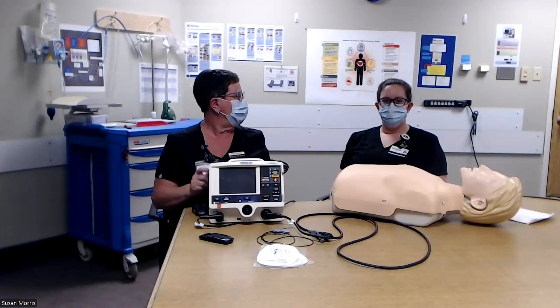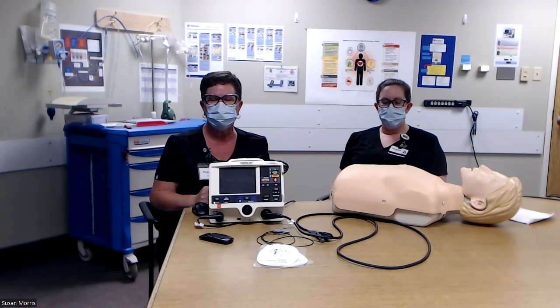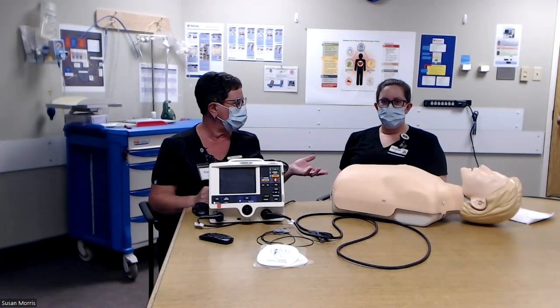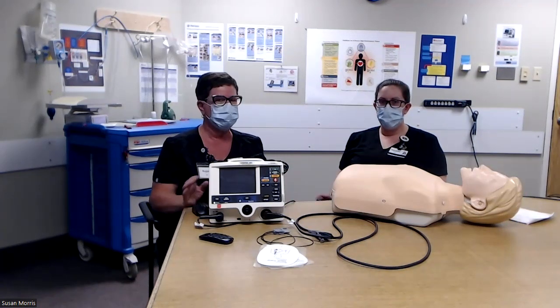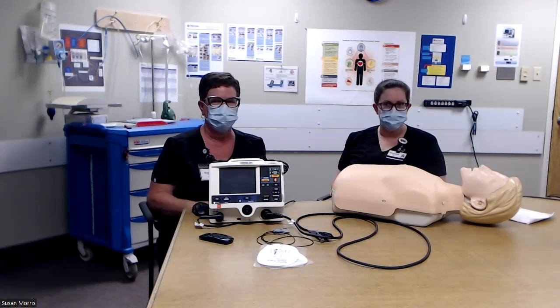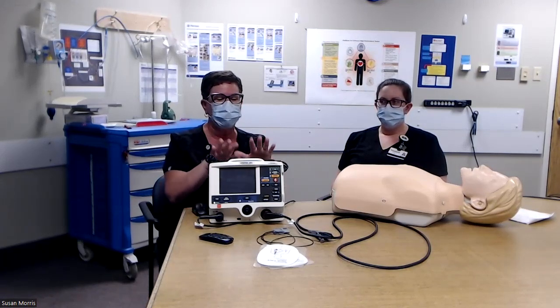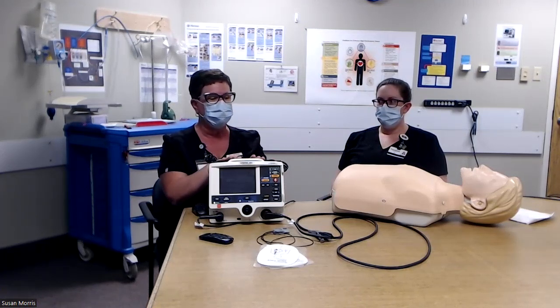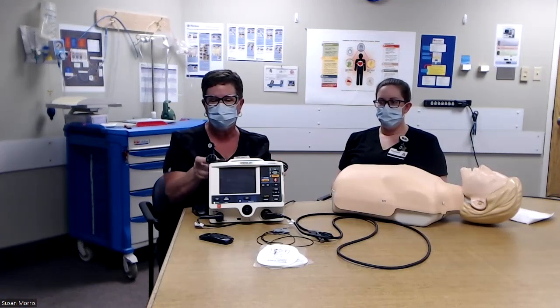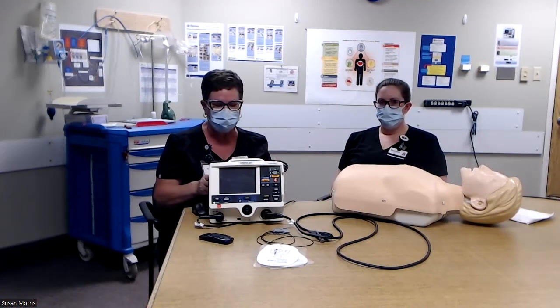Hi and welcome. My name is Sue Morris. I'm a clinical nurse educator at the New Brunswick Heart Centre, and my colleague Vanessa is the resource nurse and coordinator on the care unit at New Brunswick Heart Centre. Today we're going to give you a demonstration of how to use hard paddles if you ever encounter supply chain issues with the quick combo defibrillation pads.